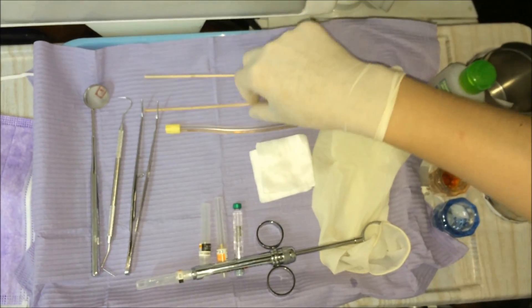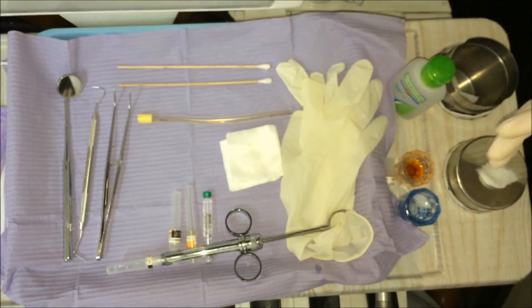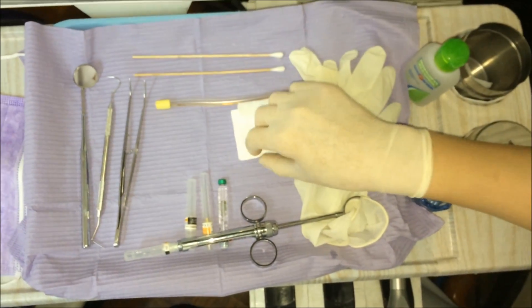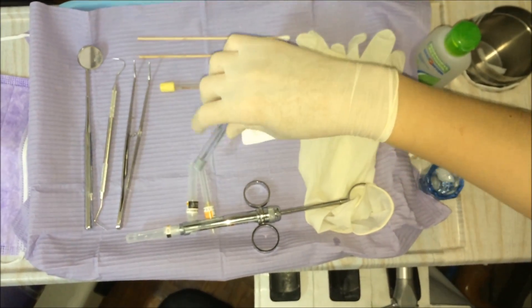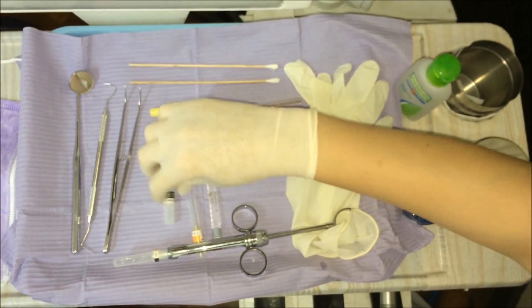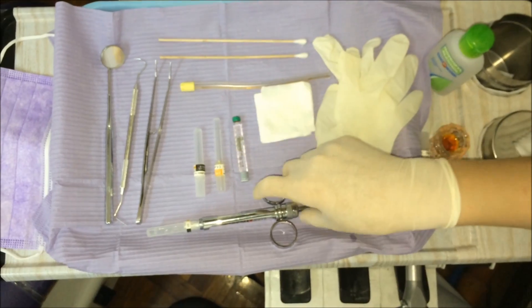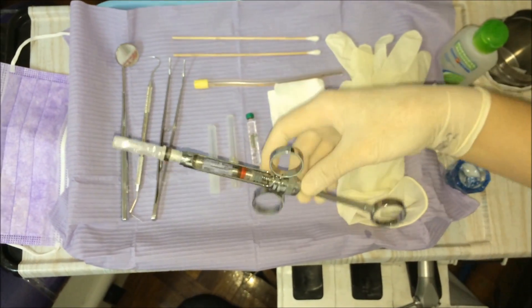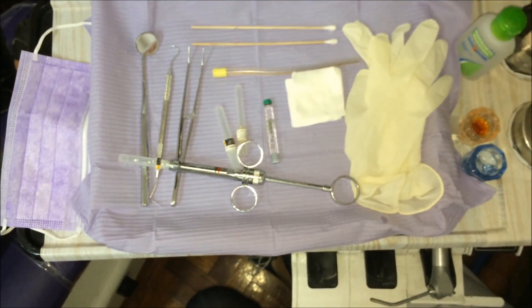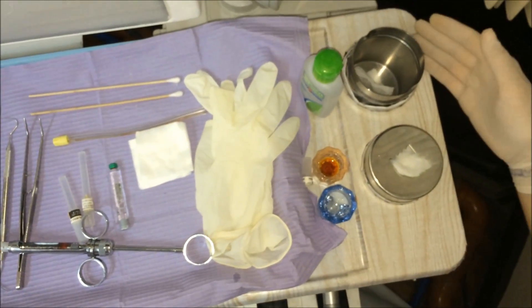We also need two swabs for application of topical anesthetic and antiseptic, sterile cotton gauze, an extra cartridge for excess use, a short and long needle for other techniques if needed, our syringe, and an alcohol and cotton dispenser.